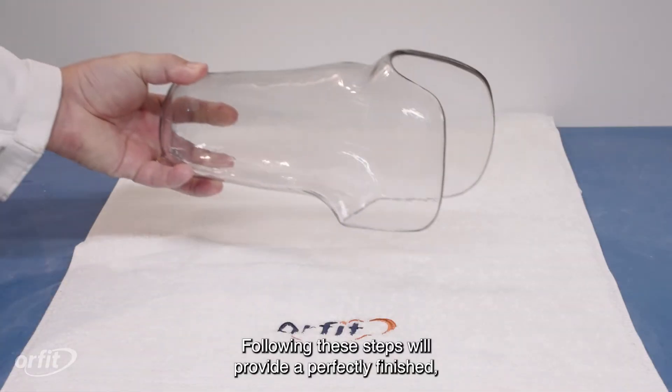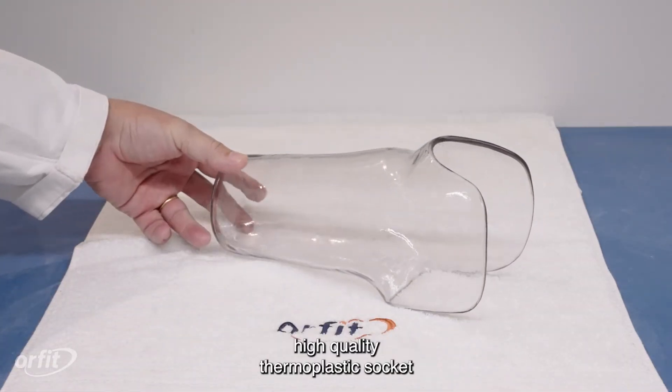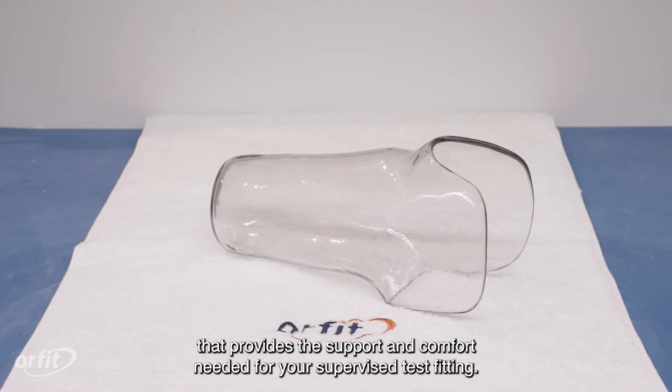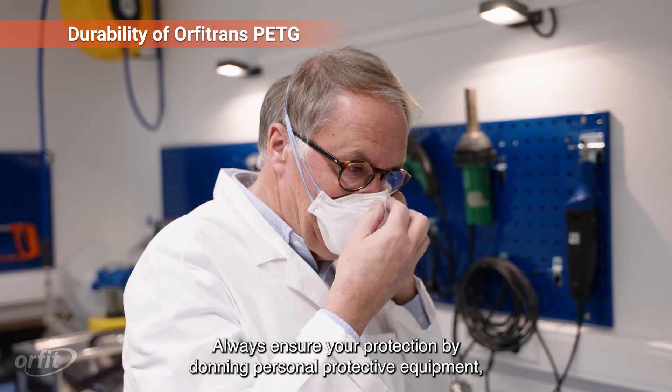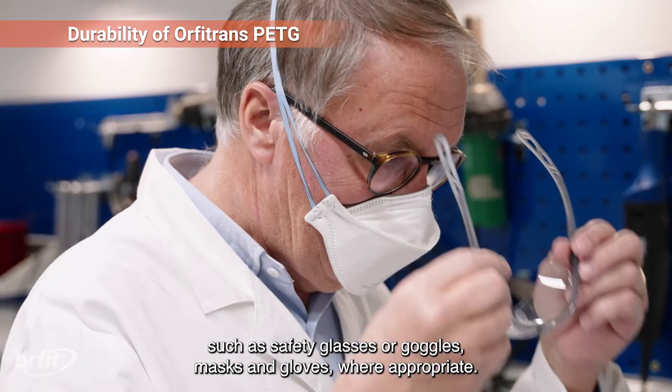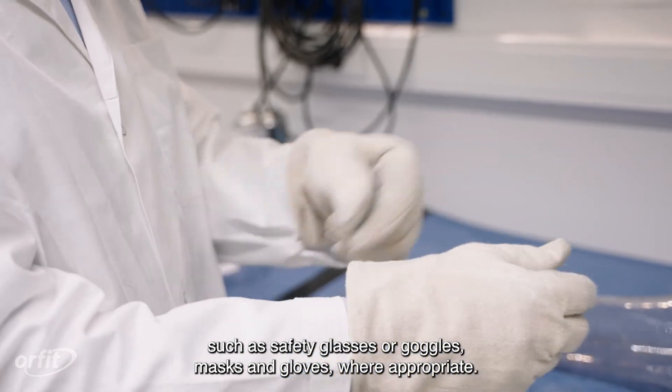Following these steps will provide a perfectly finished, high-quality thermoplastic socket that provides the support and comfort needed for your supervised test fitting. Always ensure your protection by donning personal protective equipment such as safety glasses or goggles, masks, and gloves where appropriate.